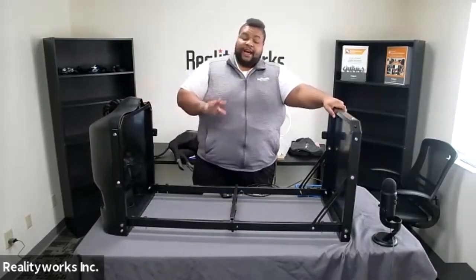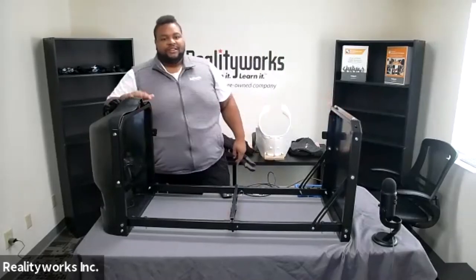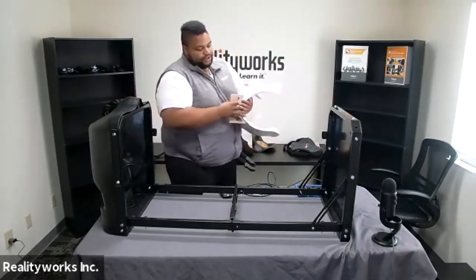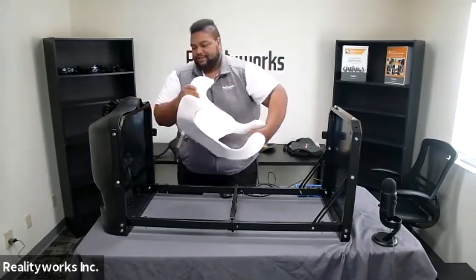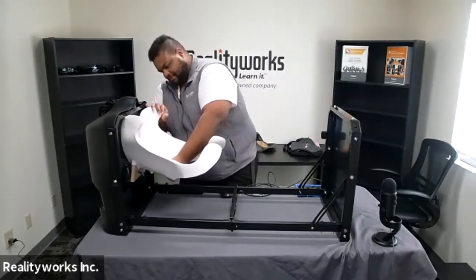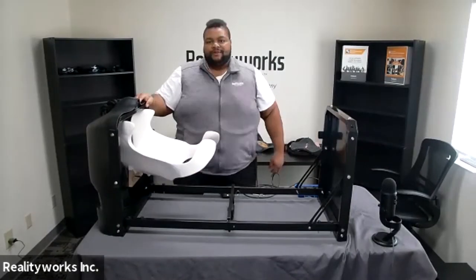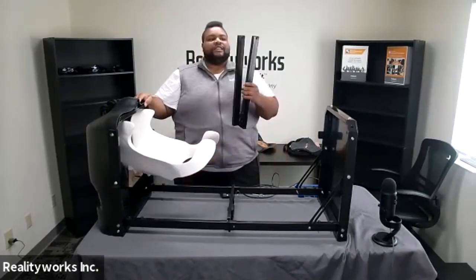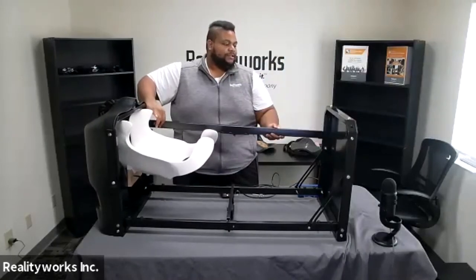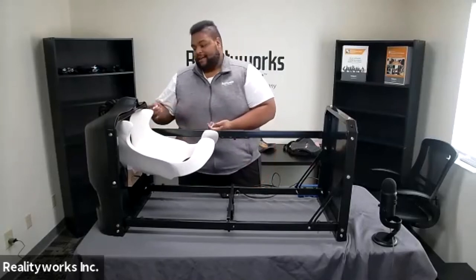Next, you don't have to do this for the ultrasound side of things, but you can insert the pelvic girdle if you desire. To do that, you just loosen these bolts and then slide it into the frame, and then tighten the bolts down. And lastly, for setting up the frame, take this cross bracket, slide it into place, and use the last three pins to lock that in place as well.